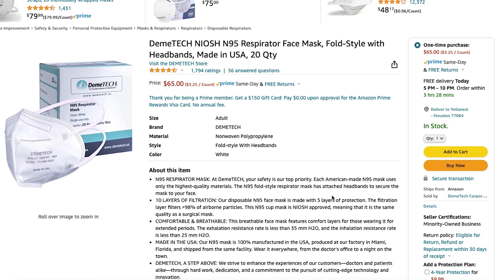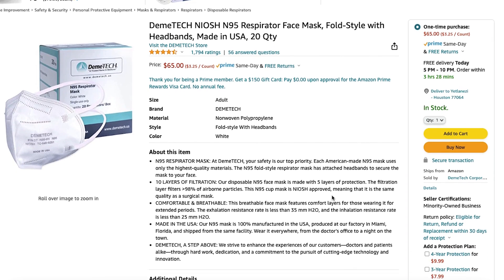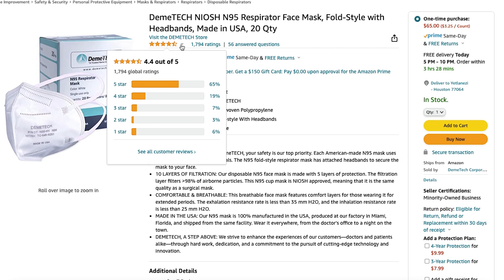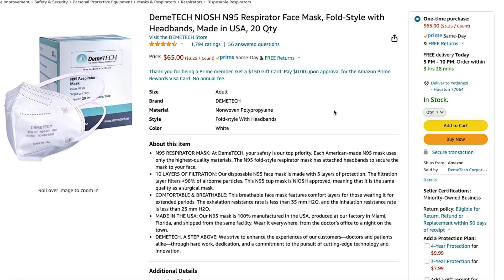These are the Demitech N95 respirators. They come in a box of 20. They do have a 4.4 out of 5 rating with 1,794 reviews. The cost is $65, making them $3.25 each, which is on the pricier side.